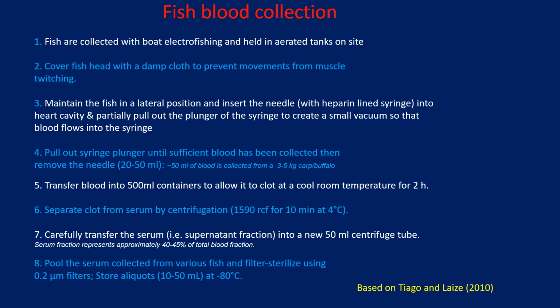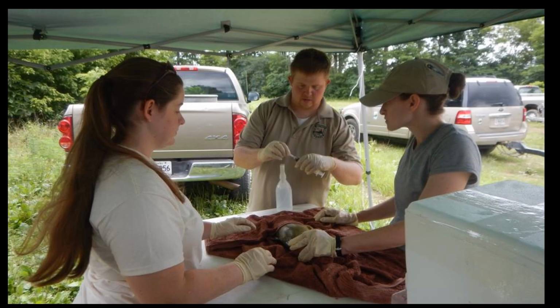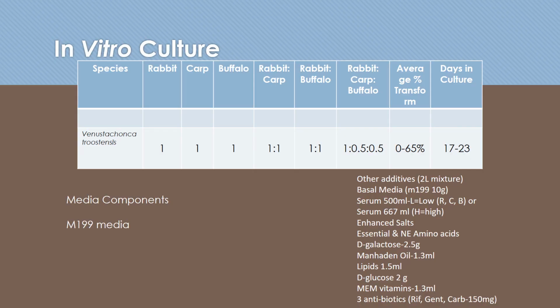a 500 ml container, and then we eventually centrifuge that and store it in a 50 ml tube or smaller, and then we sterile filter it to 0.2 microns and store it in small aliquots so we can thaw it and use it in our serum collection. Here's an example of the fish we use. This is a carp. The blood is being drawn out of the carp using a syringe.